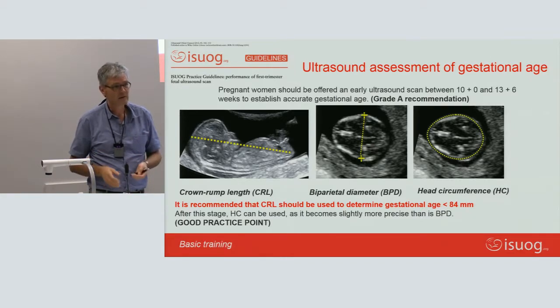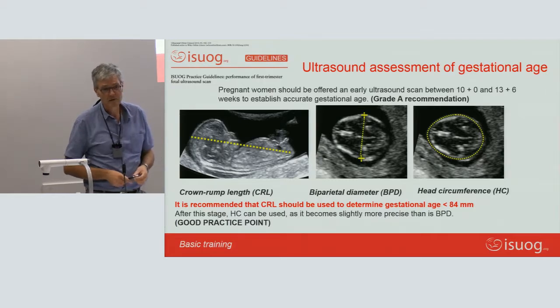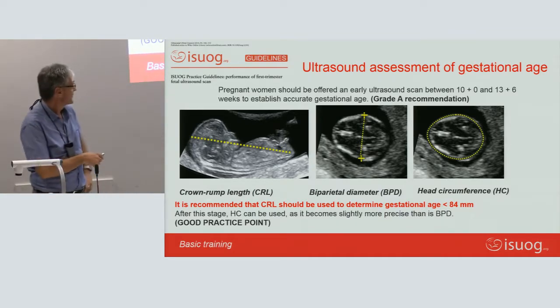Say, congratulations, you're pregnant, I see the heartbeat. I'm not going to succumb to the temptation of the granny who is also in the room, saying, oh, I just want to listen to the heart. You just show the heart and say, come back, and then we'll do the determination of the gestational age.